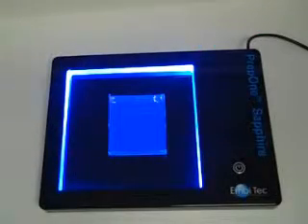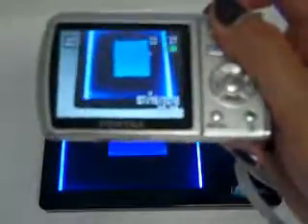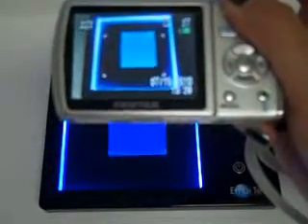Another way is to use a regular digital camera in auto mode. Any kind should work. Aim and snap.